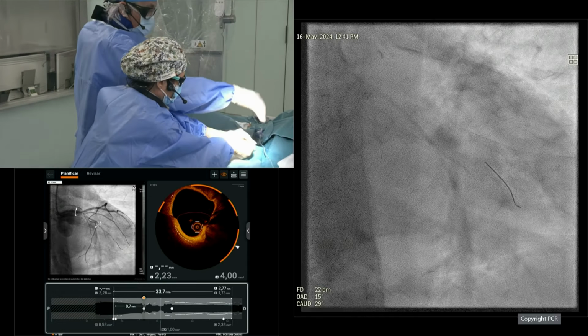We are going to go to glide assist. First we will introduce it in the catheter. We have to remove the brake. Yes, Nieves is holding the system. I'm just pressing fluoro to make sure that my wire stays in place. Which kind of Y connector do you have, Javier, with the screw or with the valve? Okay, Nieves, I'm now leaving my hands out, so keep an eye on the wire. Okay, so I'm advancing now the crown.